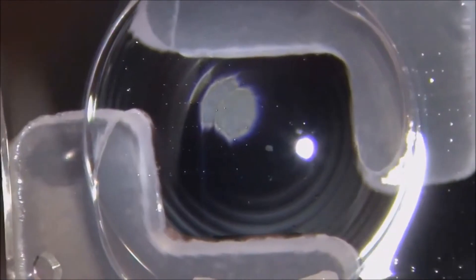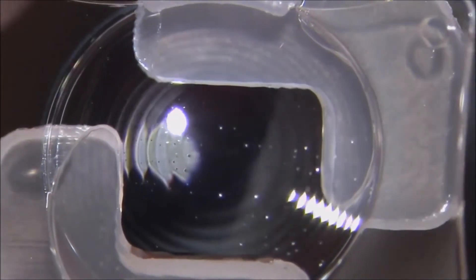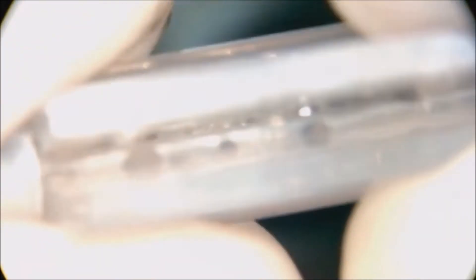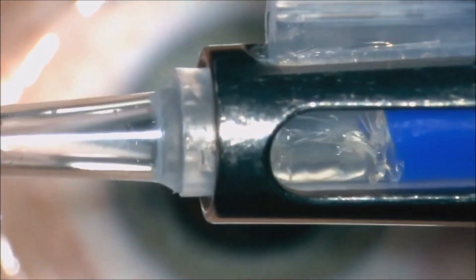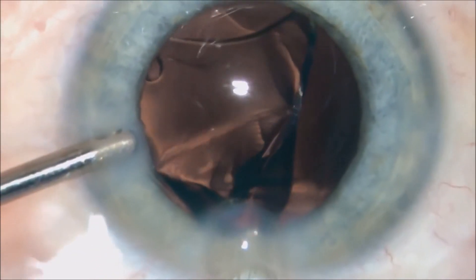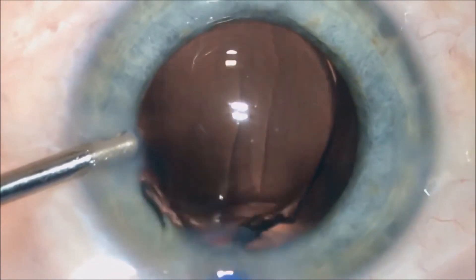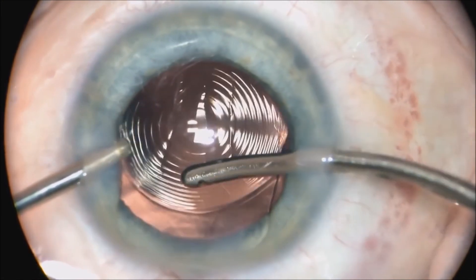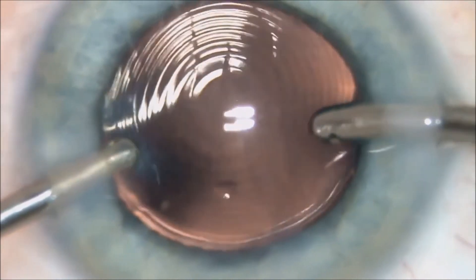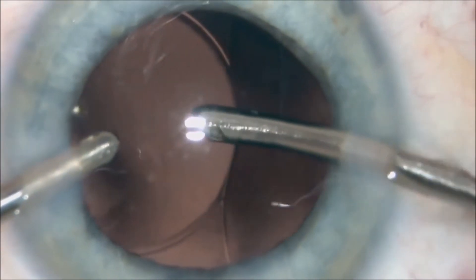We place the lens into the cartridge — you can use only BSS or OVD viscoelastic; both ways work reliably with this design. Then through a micro-incision of 1.8 millimeters, we push the lens inside and into the capsular bag. Here is a detail showing the illumination of the sinusoidal pattern visible on the lens.